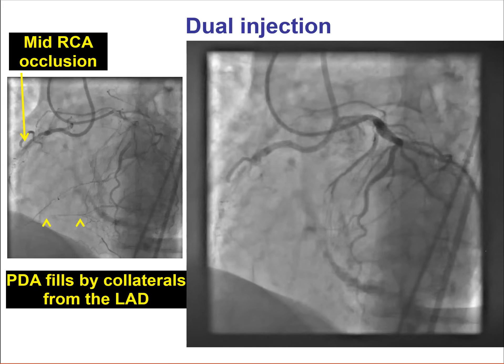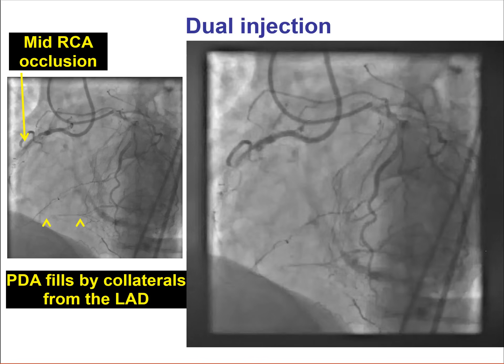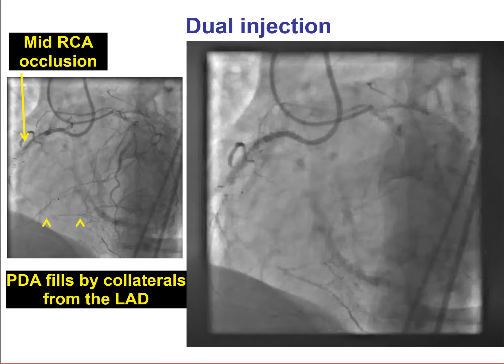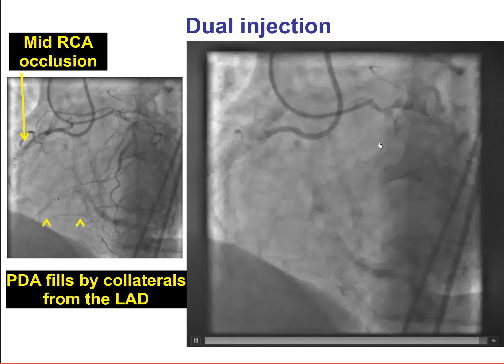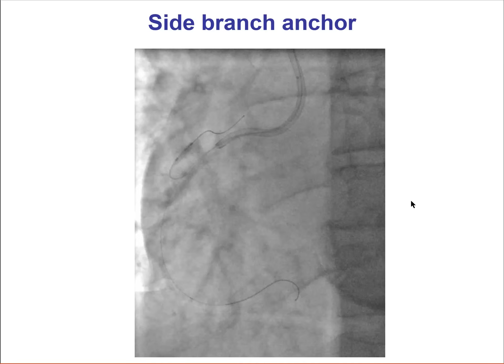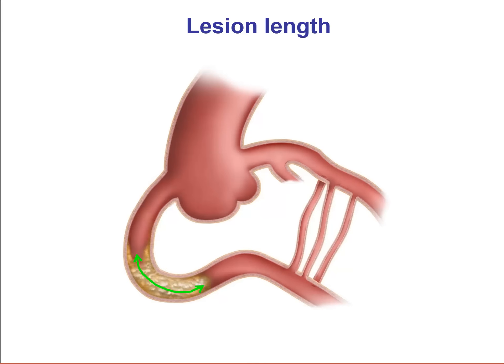This is another example of a patient with a right coronary artery CTO who has severe calcification and also has a good caliber side branch, which was used for enhancing support during attempts to deliver a balloon after guidewire crossing. The second component we look at is lesion length. Again, that's critical to evaluate, and dual injection is important because single injection invariably overestimates the length of the occlusion.